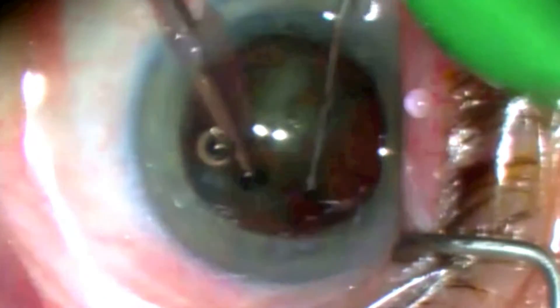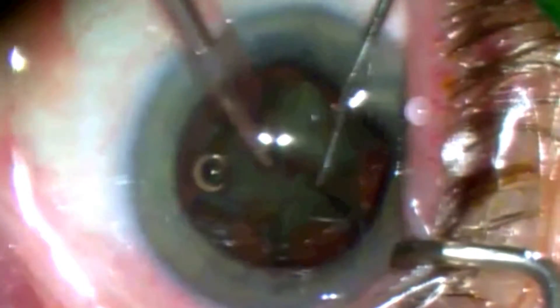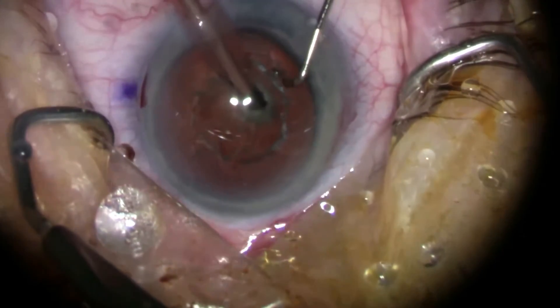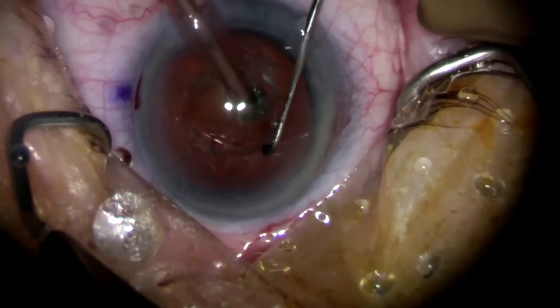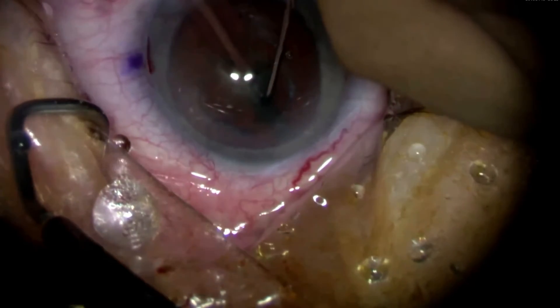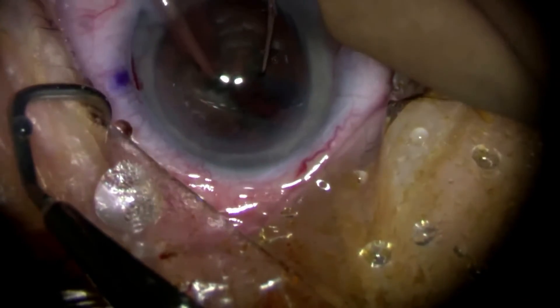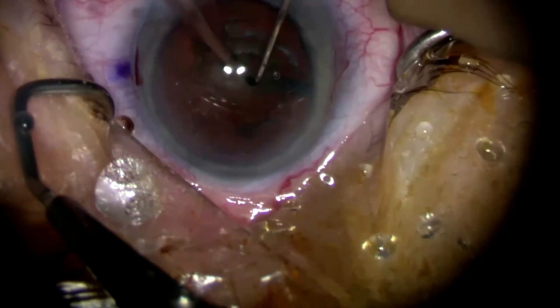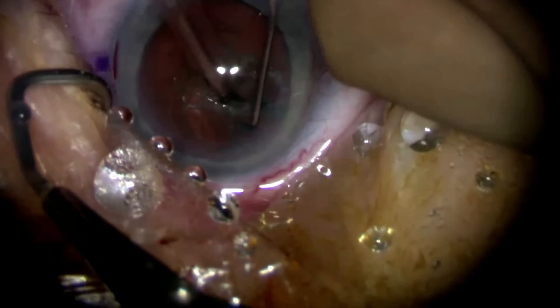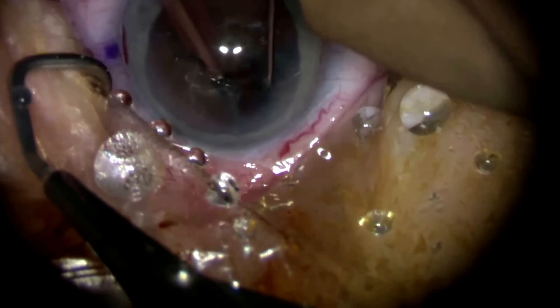We'll keep going around doing this repeatedly until we have about six pieces, and then once all the pieces are made you can start removing them, often by switching to a blunt instrument to protect the posterior capsule. Here's our fifth and final case showing the complete chopping. Again this is a fairly dense lens. We'll get deep before we start to chop, and here you'll actually see we'll use the chopper with a little bit of a horizontal motion — a slicing effect — pushing the chopper in a bit farther from the phaco tip, near the edge of the capsule, and then doing a slicing, diagonal chopping motion. This gives it a little bit of the characteristics of both vertical and horizontal chop, giving you the advantages of both techniques to really get these dense lenses to crack.